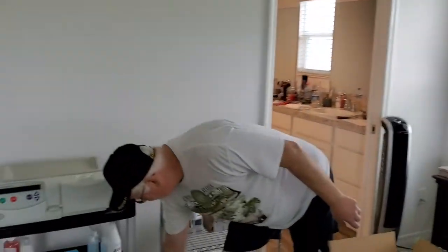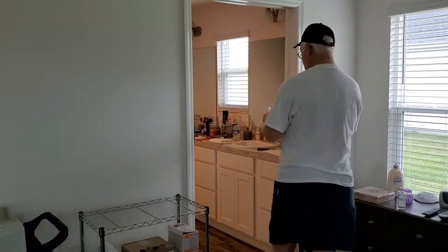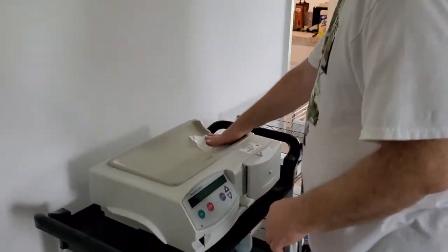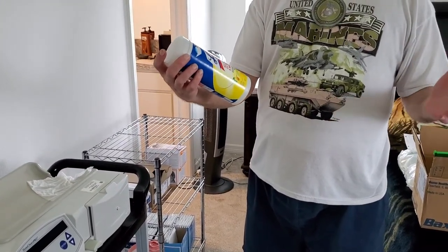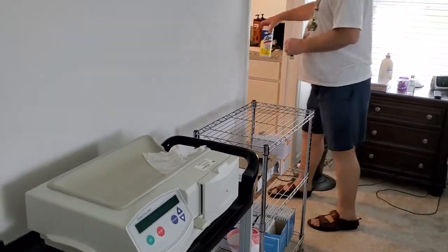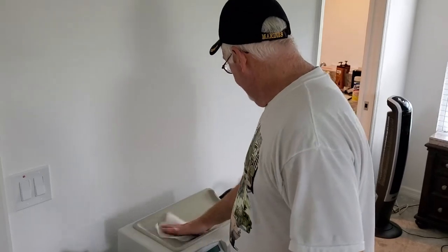The next step is we're going to need to clean our dialysis machine and anything that our solution is going to be sitting on. I wipe it down real good. I've gotten approval from my nurse to use these — they're Lysol wipes, 99.9% effective against viruses and bacteria. If you don't have these, you can use bleach and water — I believe that's a one to one hundred solution. You can verify that with your nurse, but Lysol or Clorox wipes are a lot easier to use.